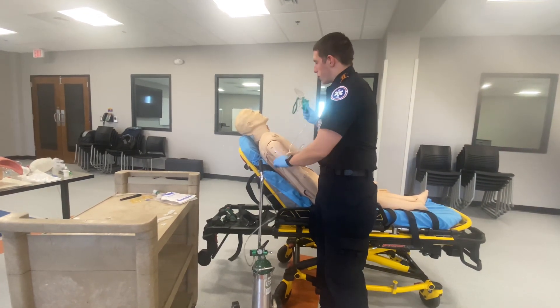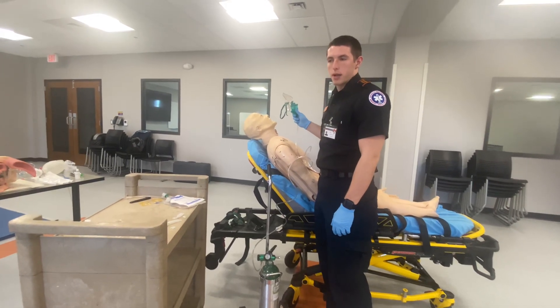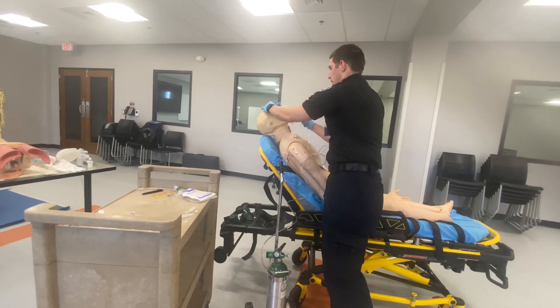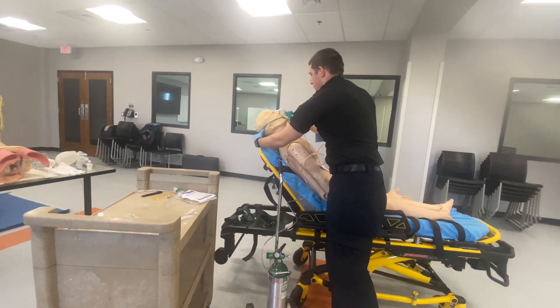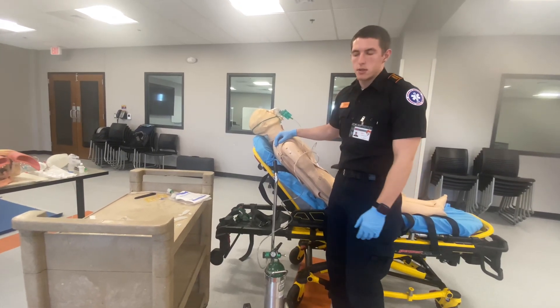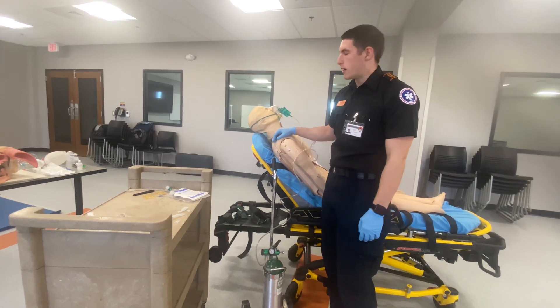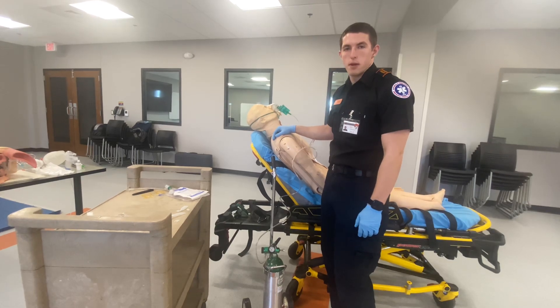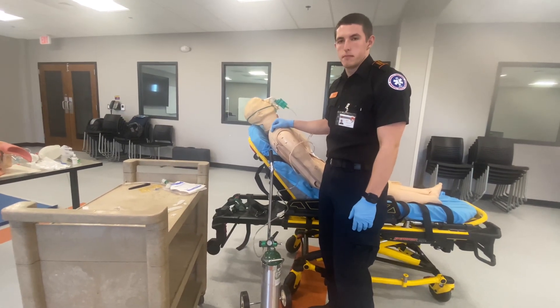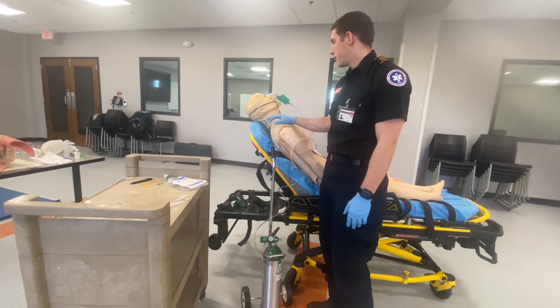I'm going to coach my patient into proper breathing — deep, slow inhalation — so that we can get all the medication in. We're going to be watching for his vital signs to improve. If they do not improve, then we're going to think about different indications and other procedures that we may use.